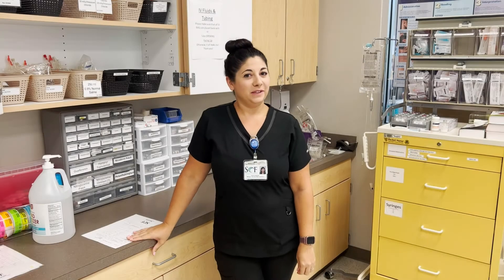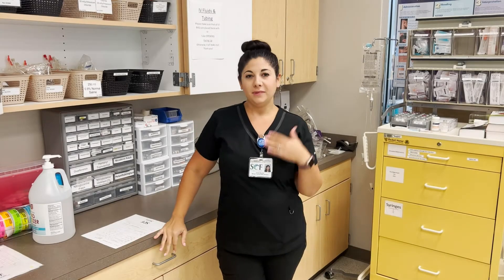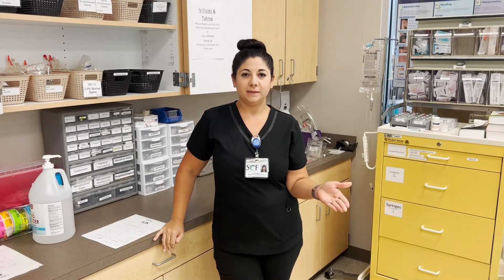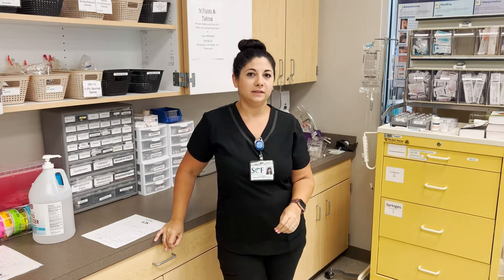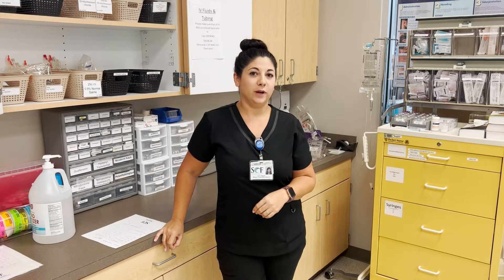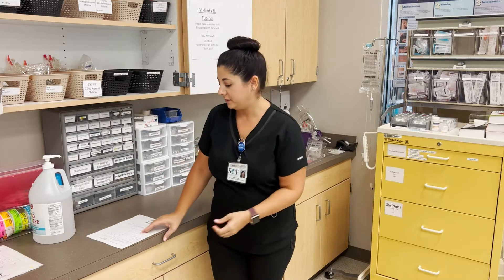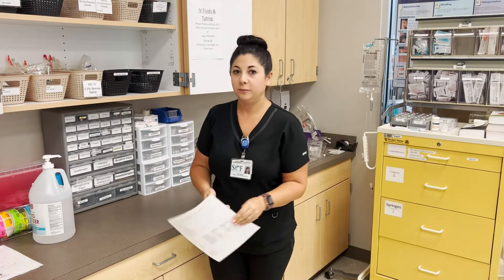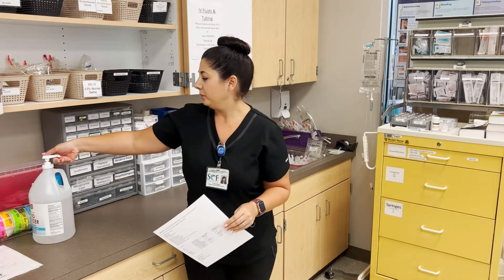We are going to be giving meds now. I have already assessed my patient, I have taken vital signs, I have assessed the need for any PRN medications that they might want, and I am coming to the med room.